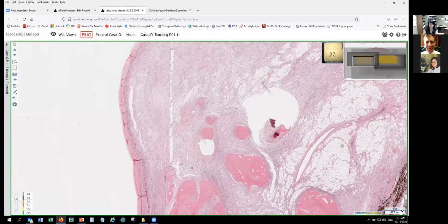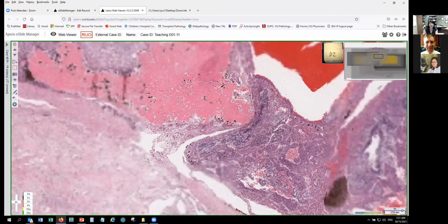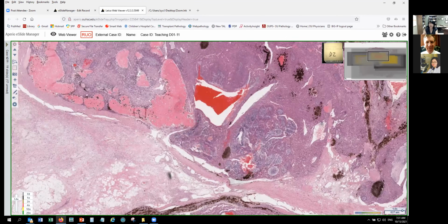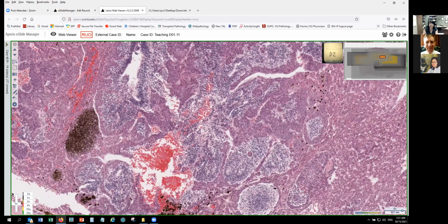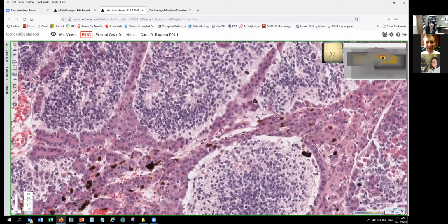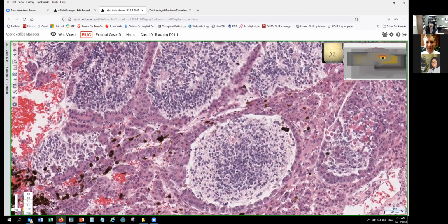And then look at this area. I said I'd come back later to this area. Oh, this is osteoid and the bone. Look at this area. There are some small blue cells, but in the background there's some neuropil, kind of neuro-ish. It's not our typical type because there's neural tissue. It's differentiated neural tissue. With neural tissue, we call it teratoid feature. So this is neural tissue, like a brain.